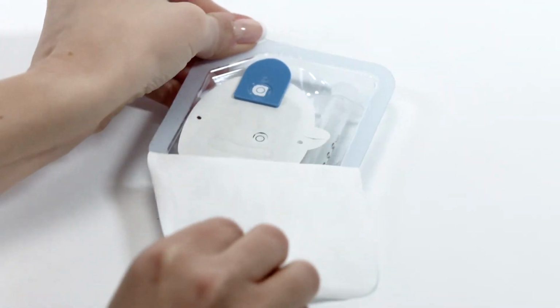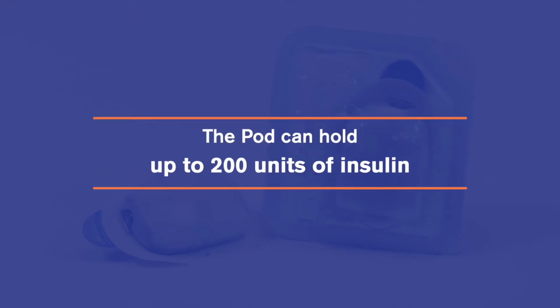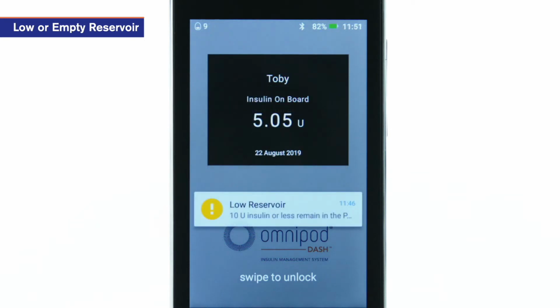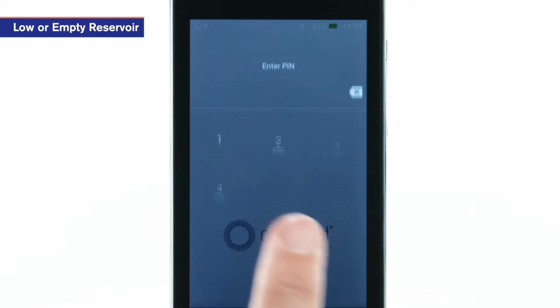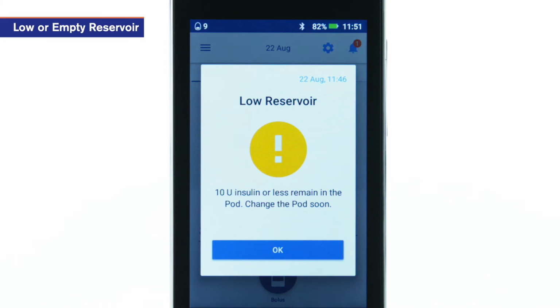A pod change is required for several reasons. First, a low or empty reservoir. The pod can hold up to 200 units of insulin. When the pod's reservoir contains less than 50 units of insulin, the icon on the status bar of the PDM changes to indicate the exact amount of insulin remaining. The PDM alerts you when the reservoir is low and suggests a pod change.